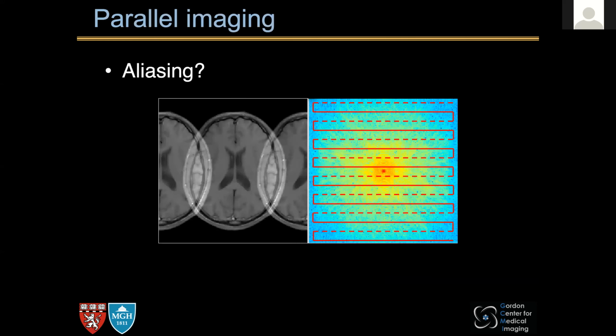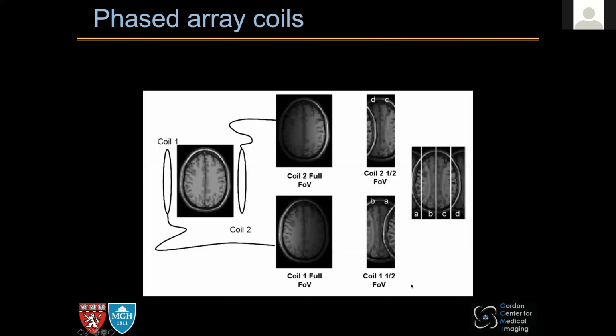Okay, so the next idea on accelerating imaging speed is to acquire less data. Again, this is a picture we saw when we talked about k-space sampling. If we don't sample the k-space data at a small enough density, we'll have aliasing in the image, which cannot be resolved without additional information. It turns out we do have a lot of additional information we can take advantage of.